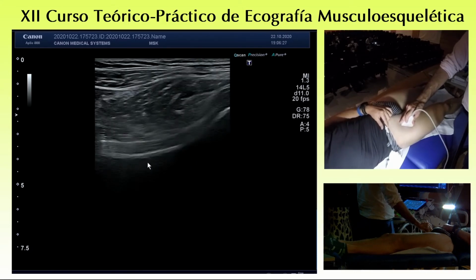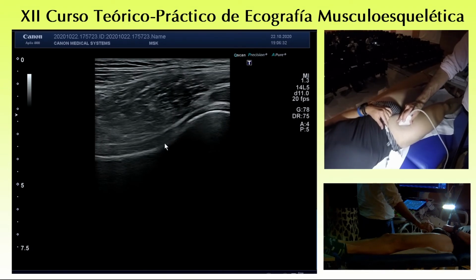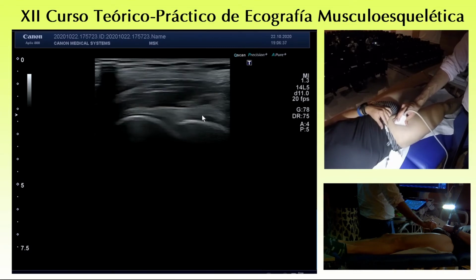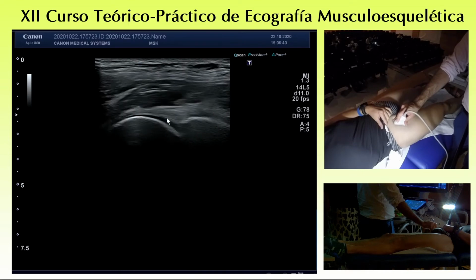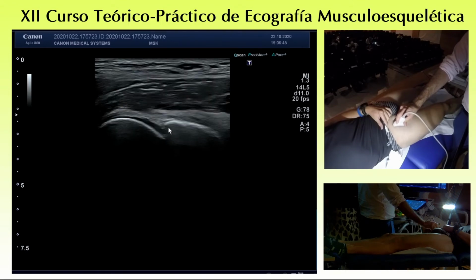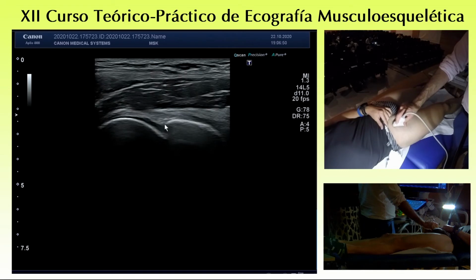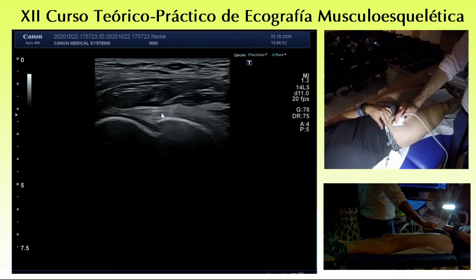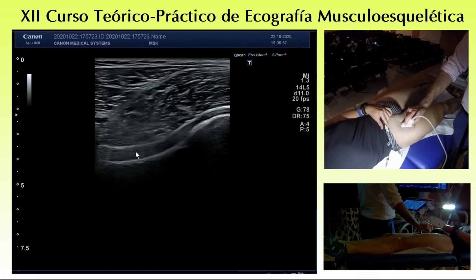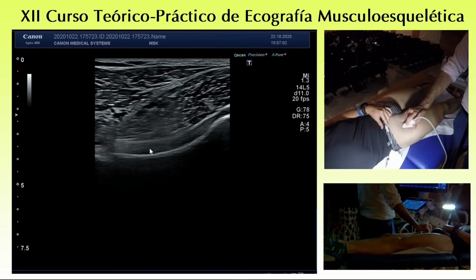and we check at this level. This is useful also to check if there is any kind of impingement, a pincer impingement. There are some papers that define the angle, you can calculate the angle for the pincer impingement. Then you move distally, and you see exactly here the recess, the anterior recess, at this point.